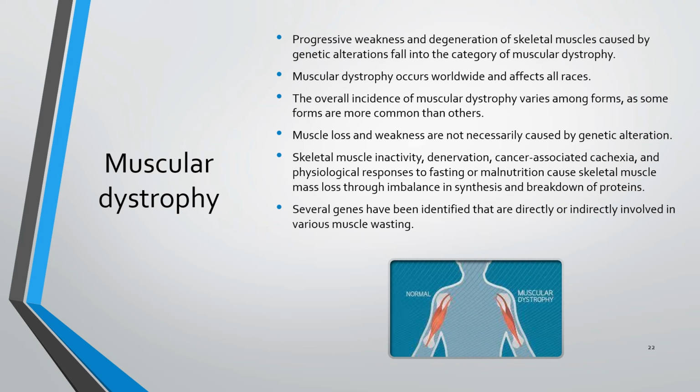They've done forced vital capacity with this. They've done some cough peak flows with this. We talked about that before. We also did some measurement of muscle strength, such as the MIP and the MEP. Also, they do what is called the peak cough flow.